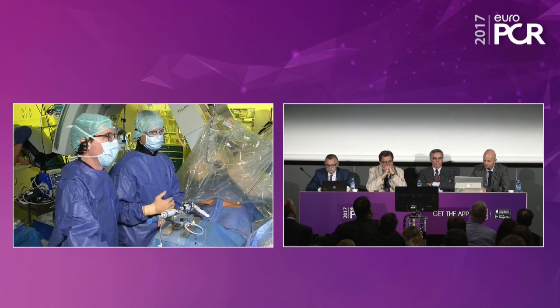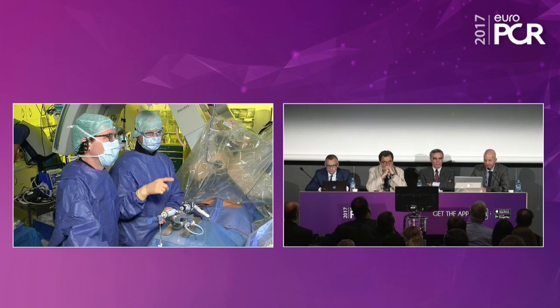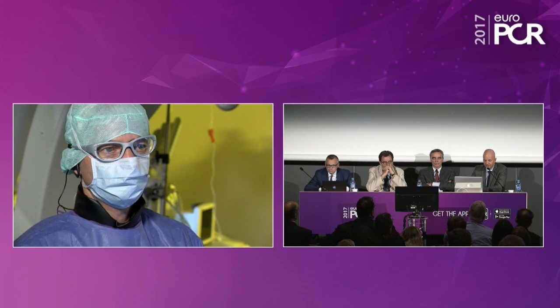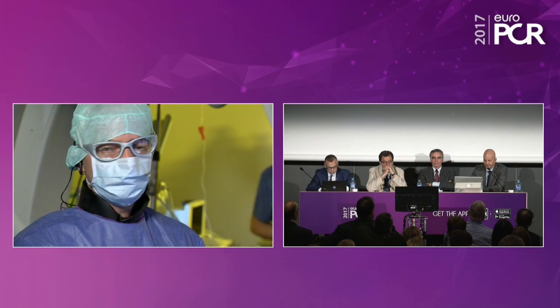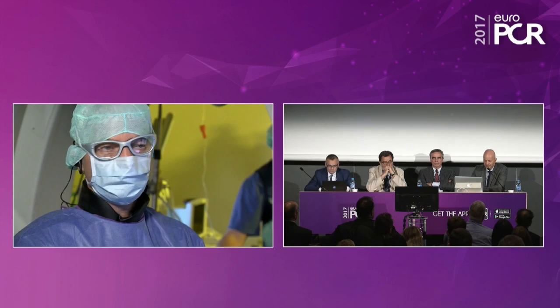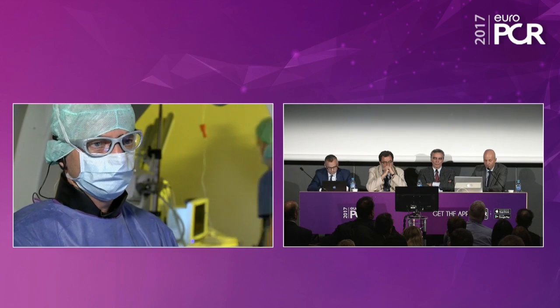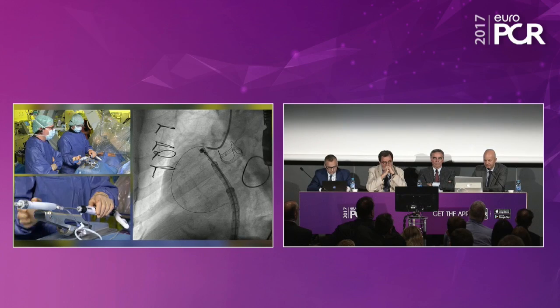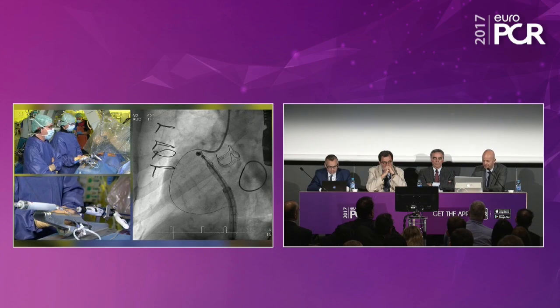And I think the next image is when all anchors are implanted. It takes a while, but you can learn quite a bit. We also did a procedure last week, and we implanted the whole fabric in 1 hour into the patient, and had some additional minutes before and after.